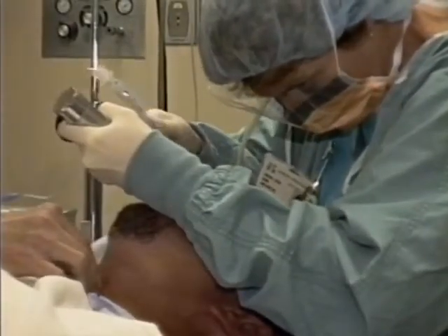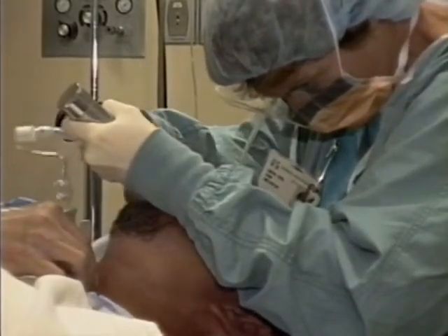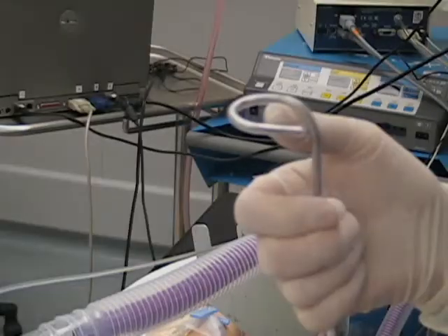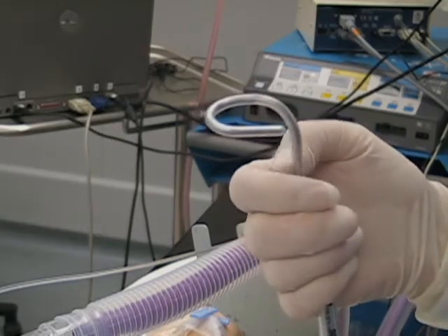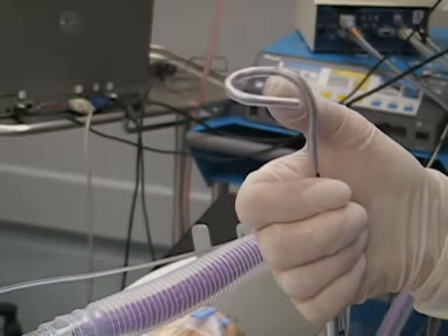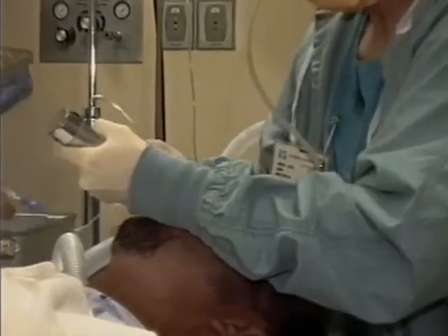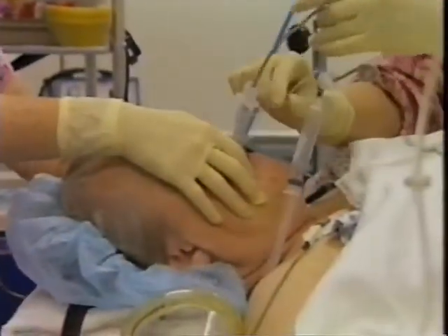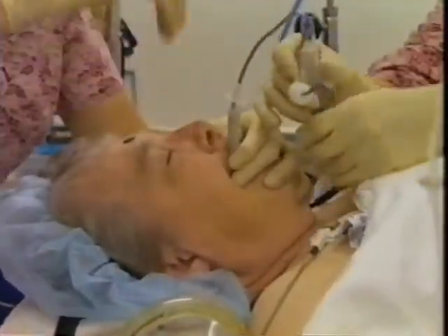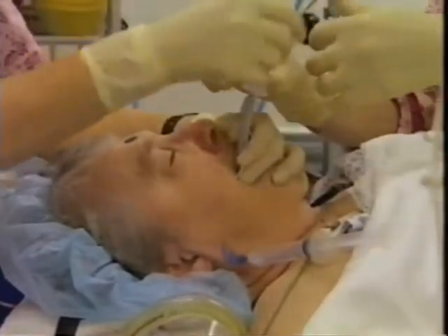A sharply bent stylet can sometimes prevent advancing the tube. If this happens, hold the tube firmly and back the stylet out several centimeters with your thumb. Push the tube forward into the trachea once the tip is free to flex. You may need a helper to pull the stylet out for you while you hold the tube and advance it.